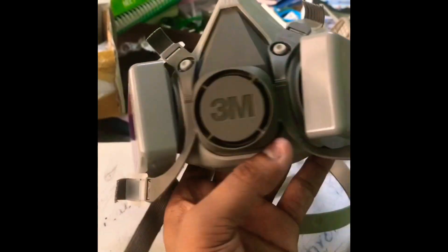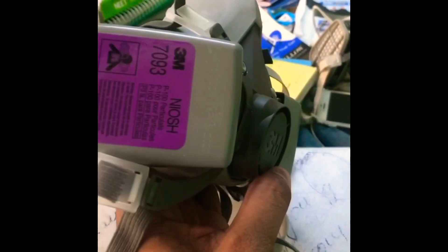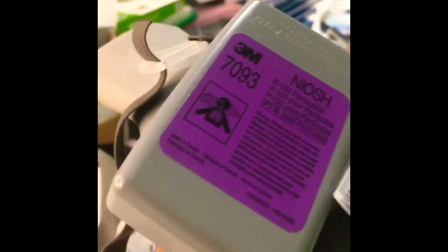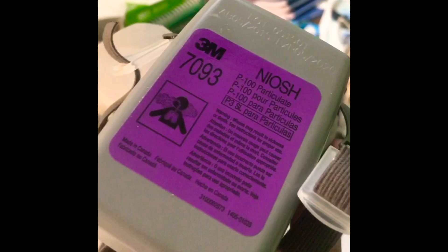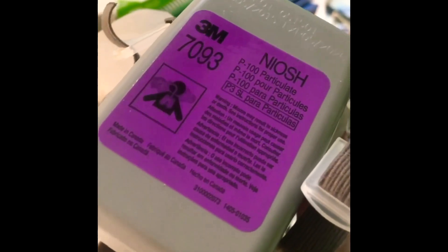That's how my mask looks with this add-on filter, which is model number 7093. It looks pretty amazing and it has 99.97% filtration, so you can be really safe and feel safe.